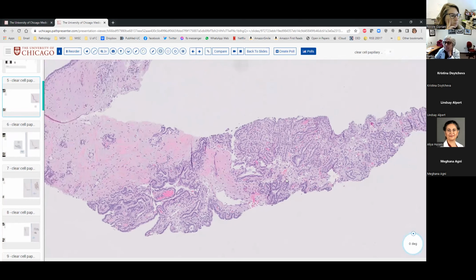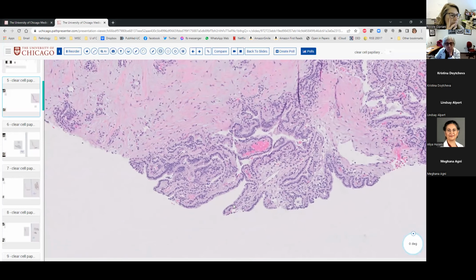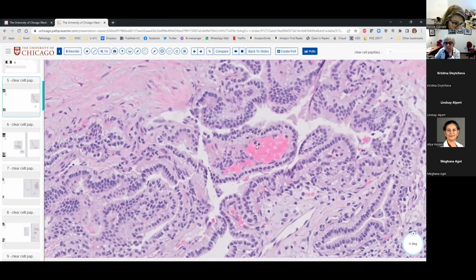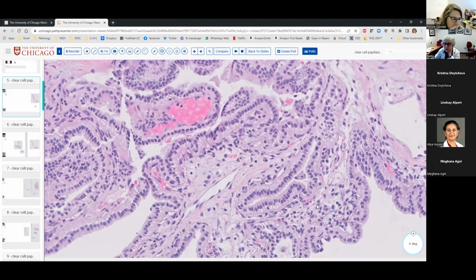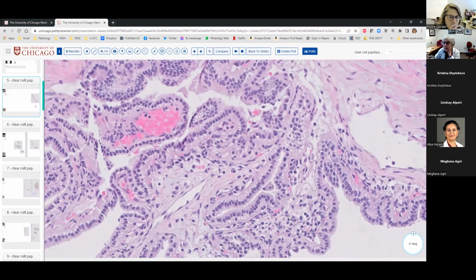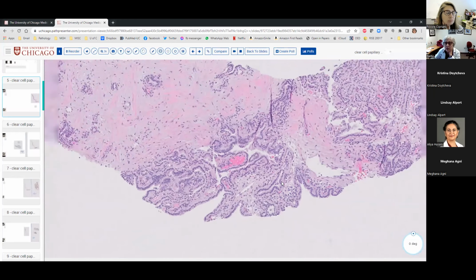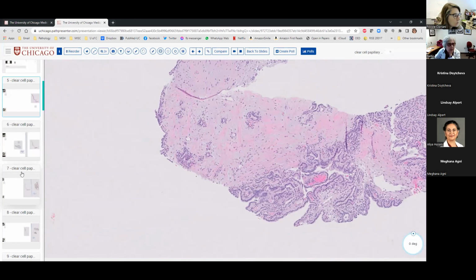Okay. In the bottom left, that stroma and by that sort of empty blood vessel in the middle, if you go higher, right here, not there. Yeah, it's right there, in the lower part. Don't you think those are macrophages in the stroma? I see some plasma cells, but I'm not 100% sure. I see macrophages. Nevertheless, there are only a few if there are any, right? Okay, fine. What is next, case?